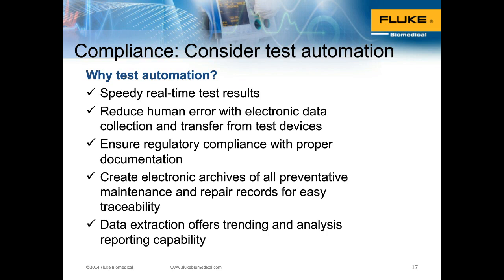And of course, everyone's striving to be compliant here. So the work needs to be done. Some of the things to consider in terms of compliance is to automate the work. When you automate the work, what you're really doing is not just speeding up the testing time, you're reducing human error or the potential of it by standardizing the work.